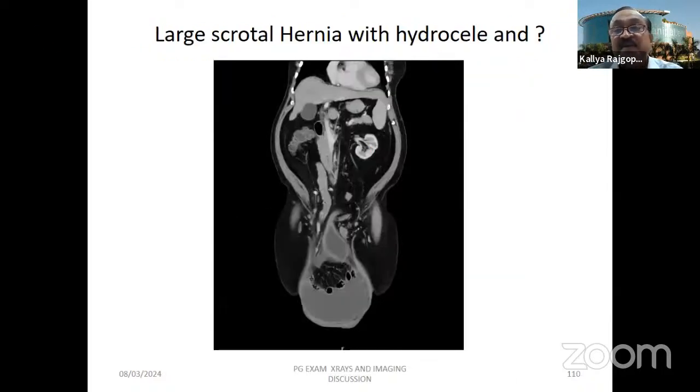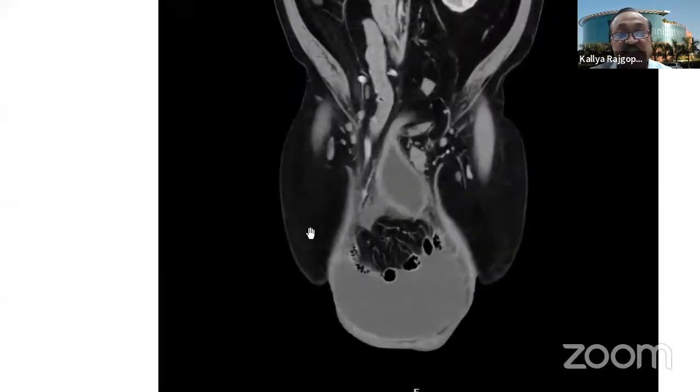One of the quiz questions here: you can see the abdomen is distended, but not much fluid there. It's obesity. Carefully, if you see, this is the scrotum and a collection of fluid there. Yes, you can see a hydrocele. Look at the cocooning effect of the small bowel there, a lot of reaction. And I want to show you this structure.